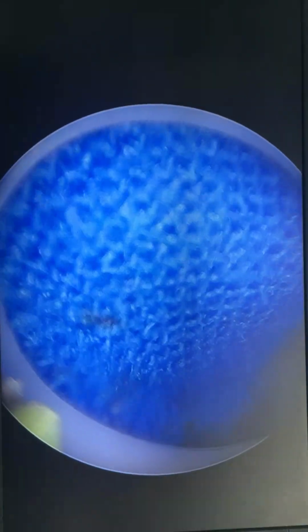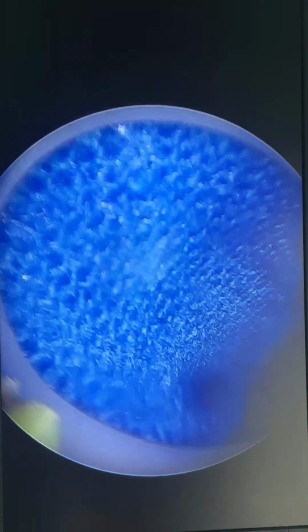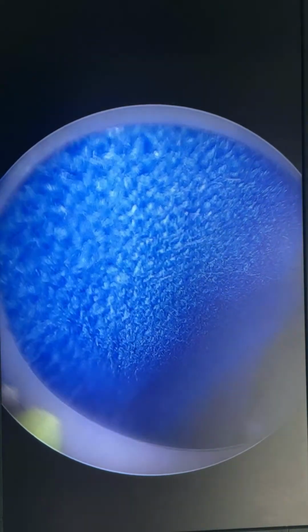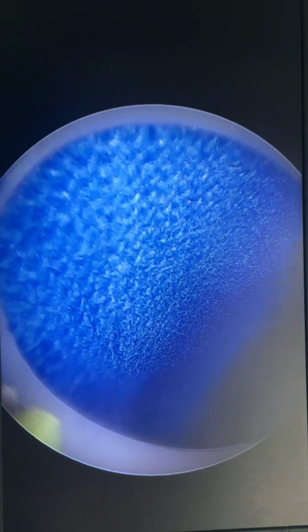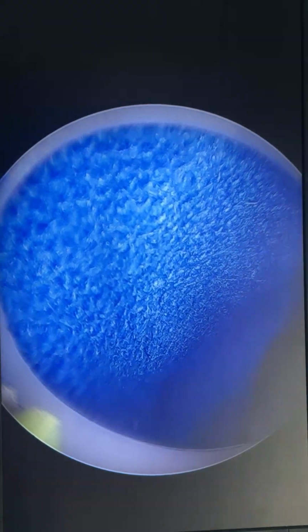But the cutting away of the niche is far better with the resectoscope. It was looking like a very small sac, but finally it has come out to be more sizable than what it looked like on ultrasound.